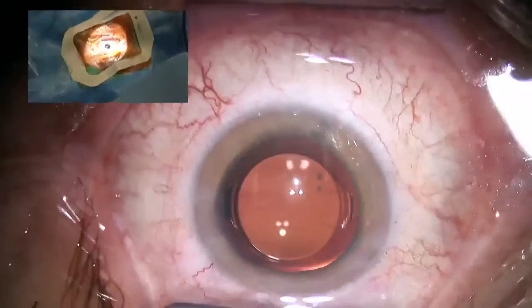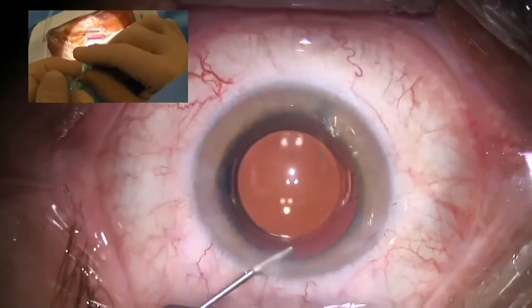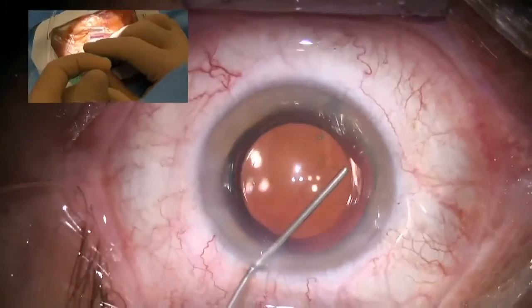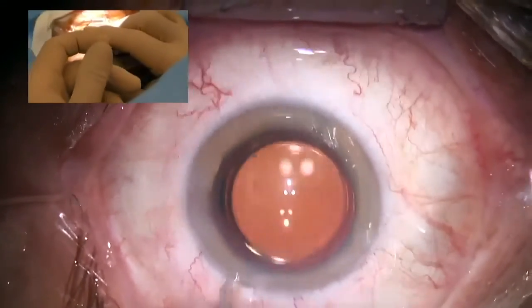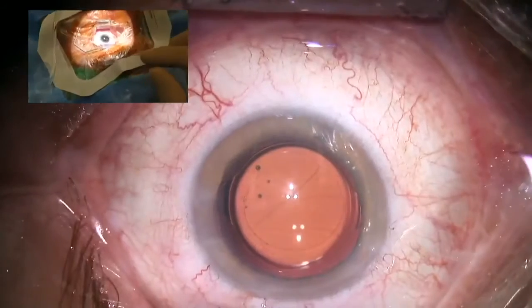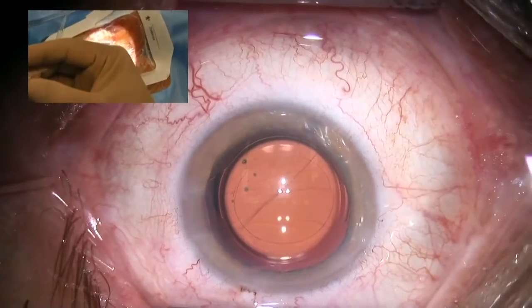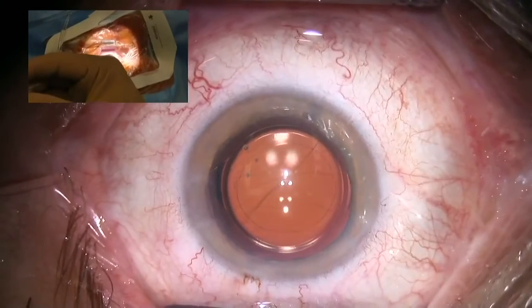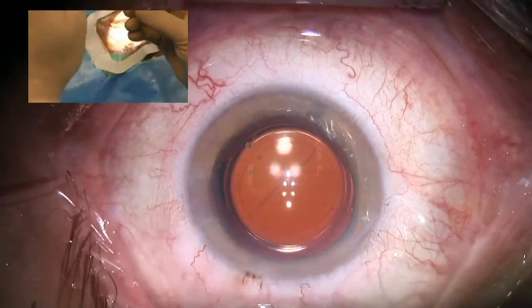In terms of fluidics, are they comparable? Also in terms, yeah, very comparable. Also, if you go up to Lux 3. If you end up in Lux 4, you need more BSS. But it's also a function of experience, to be honest. If you start doing nanolaser, I would not recommend to start with Lux 4.